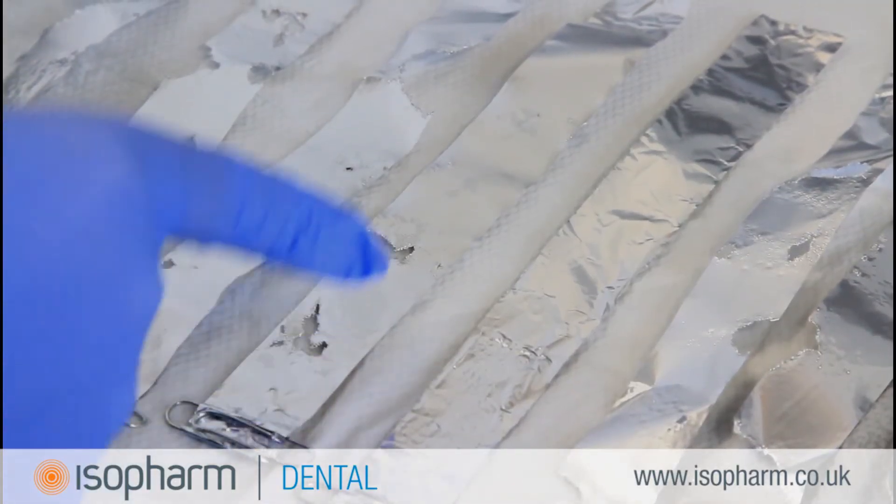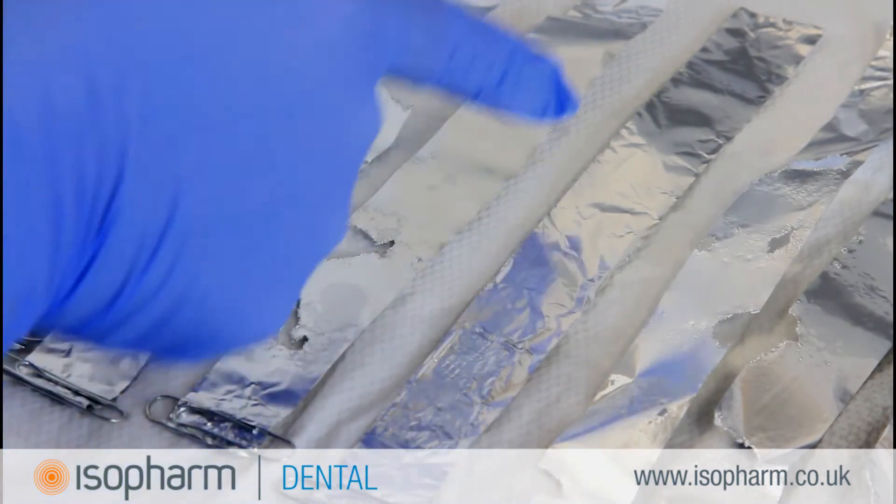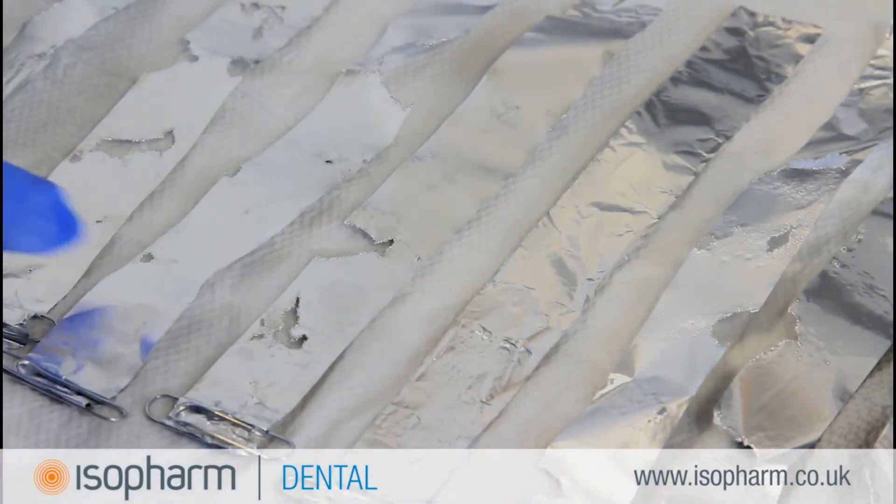No foil erosion on one or more of the foil strips indicates a possible dead area of the tank, and that one or more of the transducers may not be performing as intended.